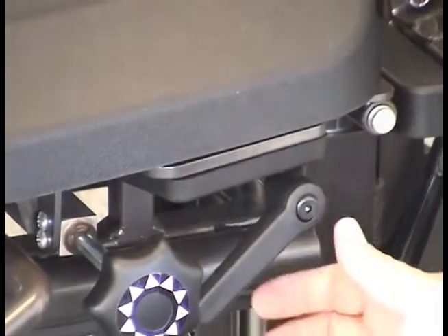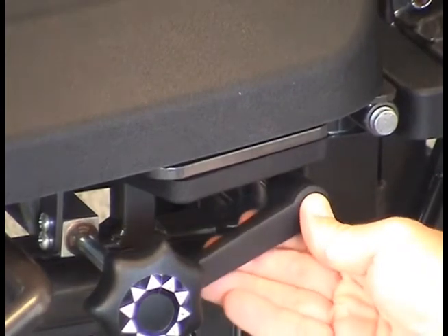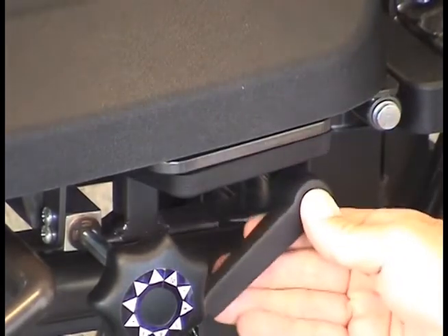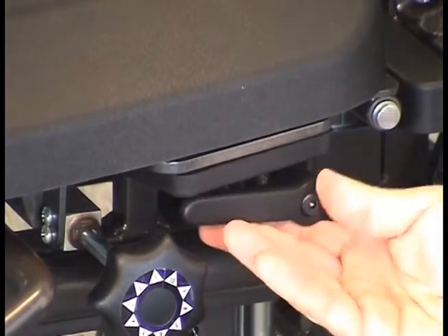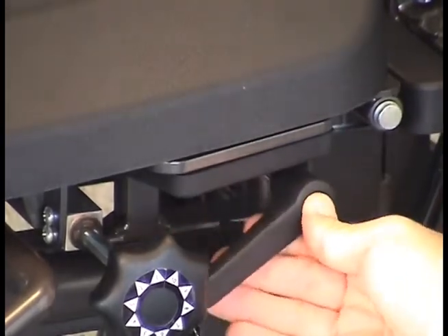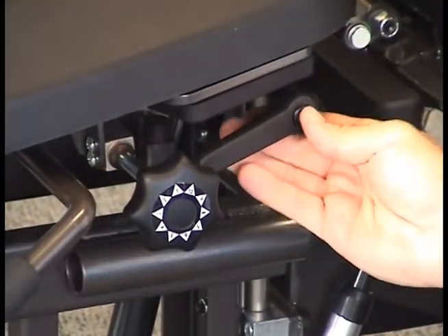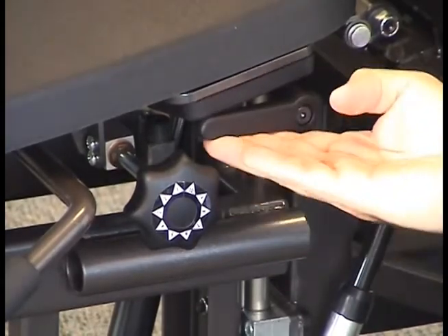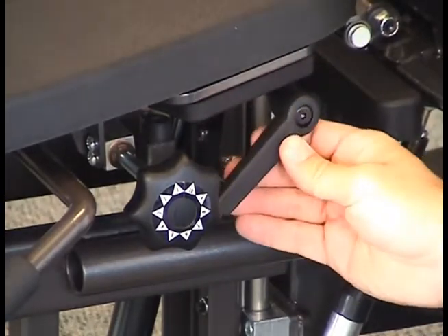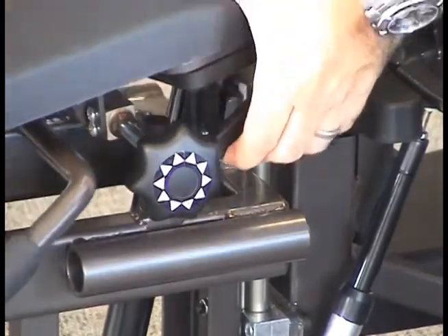If you place your thumb on any round black nut and pull it out on a plastic cylinder release lever, you will be able to change the position the handle locks in. It is essential to have enough travel between the handle and the bottom of any section of the table in order to release the cylinder and allow for movement. Many practitioners are concerned with cylinder failure when in actuality the cylinder has not failed. The handle is probably in the wrong position, not allowing for enough travel to engage the cylinder.